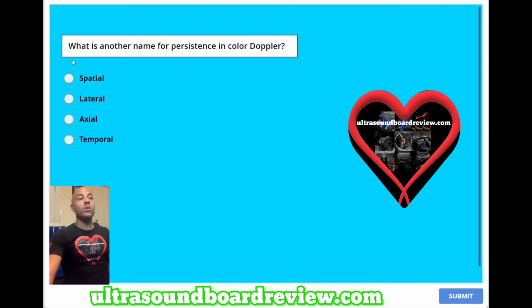Question 32. What is another name for persistence in color Doppler? A, spatial, B, lateral, C, axial, or D, temporal? The answer is D, temporal, or in other words, temporal compounding.